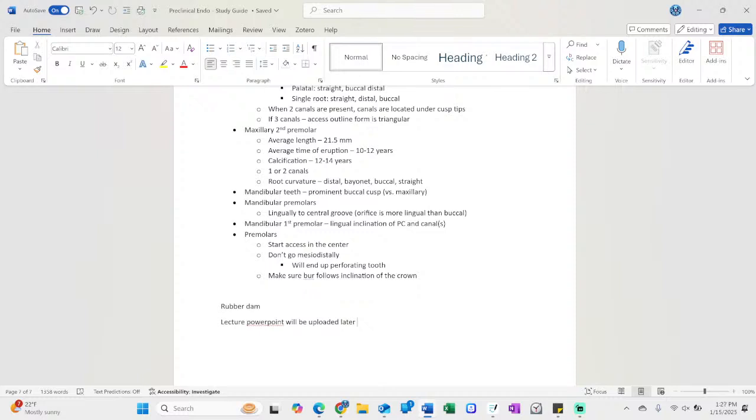So, obviously some issues with these radiographs here is that there's no rubber dam. So, we're not protecting the canal and the inside of the tooth from the bacteria and the saliva and the fungi and all those sorts of things that live in our mouths. But we're also not protecting the patient from things dropping down their throats, the medicaments that we're irrigating the tooth with.